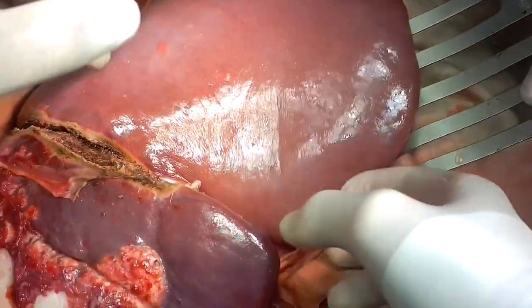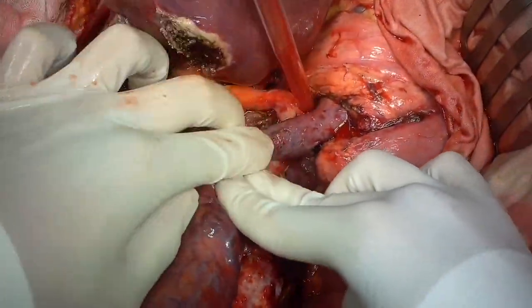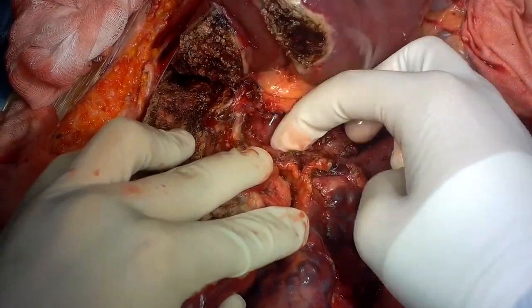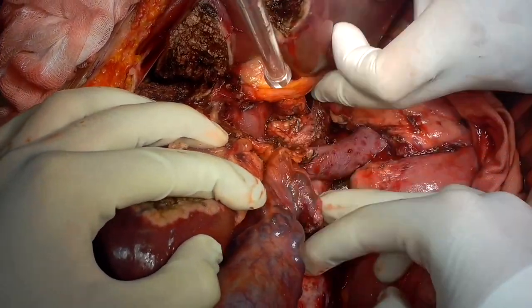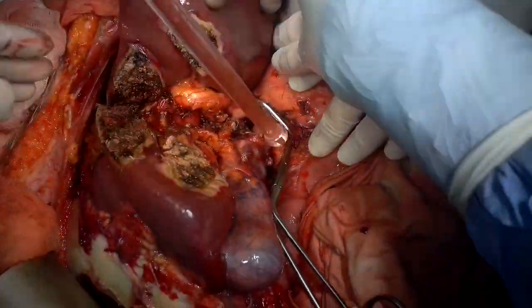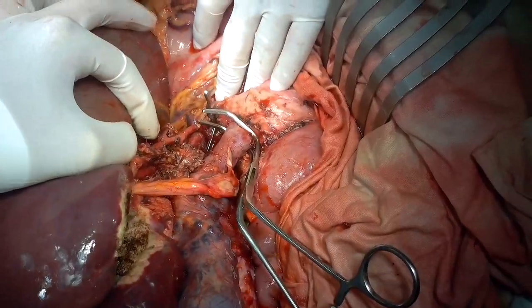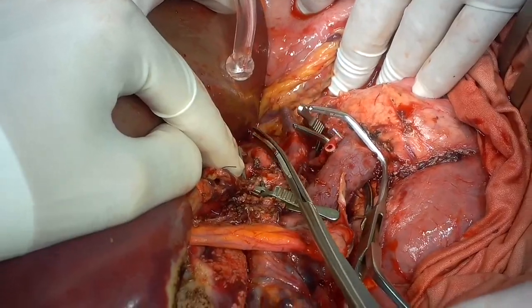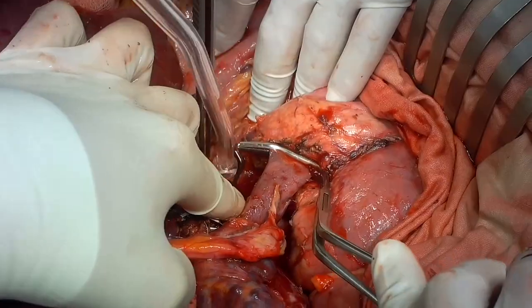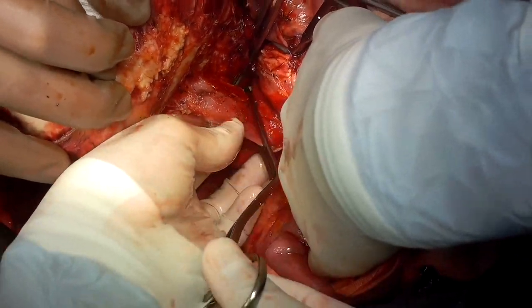At this point, the liver parenchyma is partially divided. All main vessels have been isolated and prepared for liver removal from the abdominal cavity. You can see the portal vein — the lesion surrounds it. I have fitted a vascular clamp under the portal vein and did a test clamping. The artery is also dissected free. I apply Bulldog clamps and cut the artery between them. Now I close the clamp on the portal vein at the confluence of the splenic and superior mesenteric vein. We now clamp the inferior vena cava in the infrahepatic section.